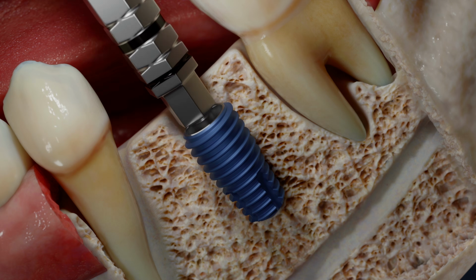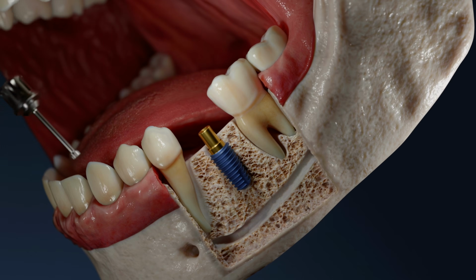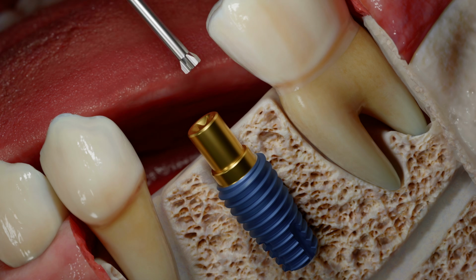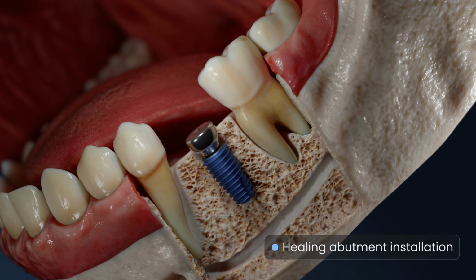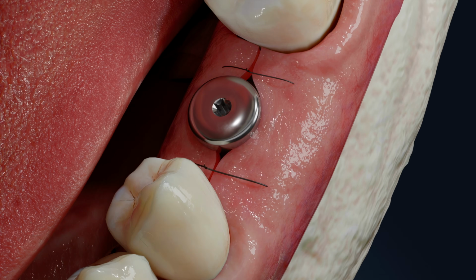Next, a guide pin is inserted and a bone profiler is used to reduce the bone above the implant to allow accurate placement of the healing abutment without contact with the bone. After removing the overhanging bone margins, the dentist inserts the healing abutment. The wound is sutured. Osseointegration occurs within 3 months.